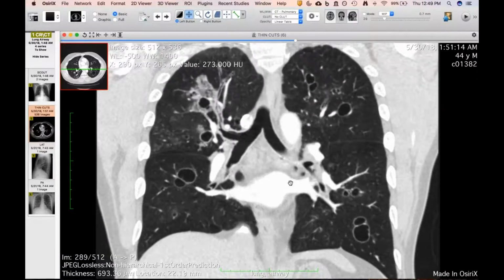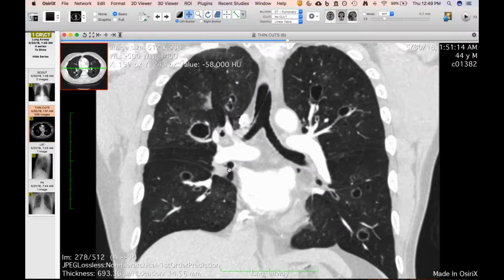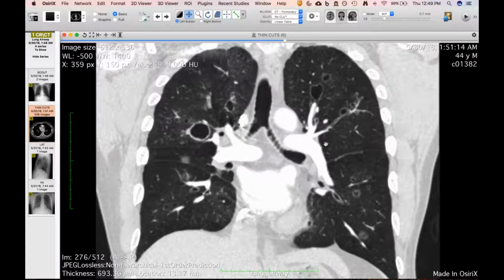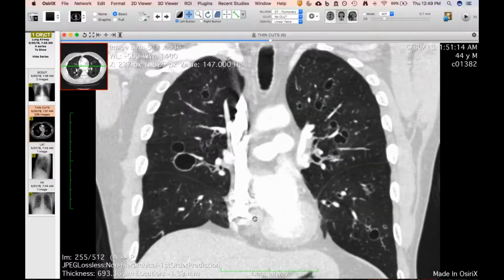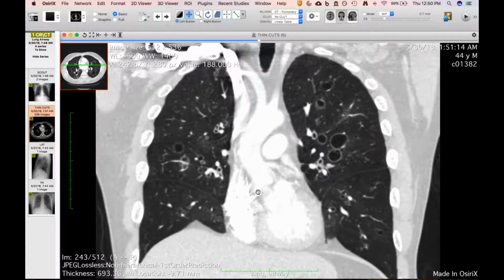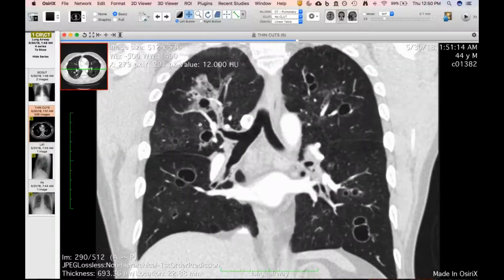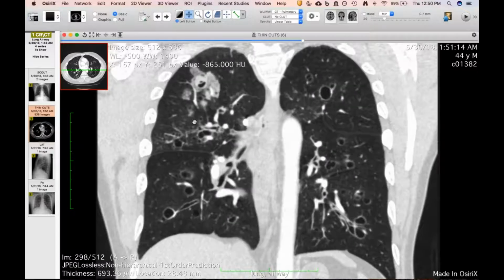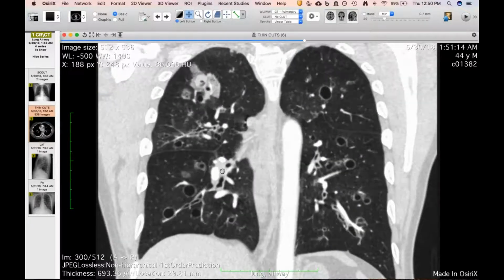I think it's interesting too. There's several little tracheal diverticula. But yeah, I kind of agree with Seth though, that when you damage the more proximal airways, you're going to end up with more distal infections. So he could be colonized now or just having repeated infections from the inability to clear more proximally. Definitely infected. I mean, it's just like every CF patient, every CF patient's got 50 strains of whatever growing in their airways. You expect the same thing here.